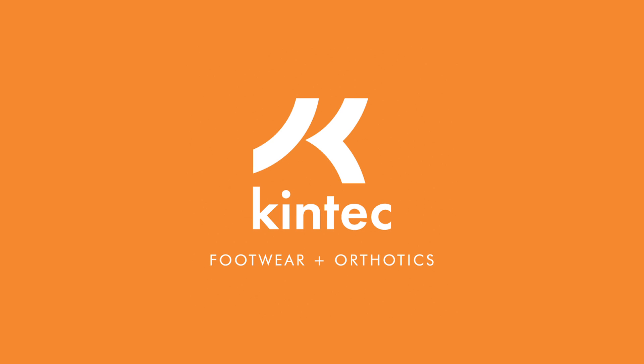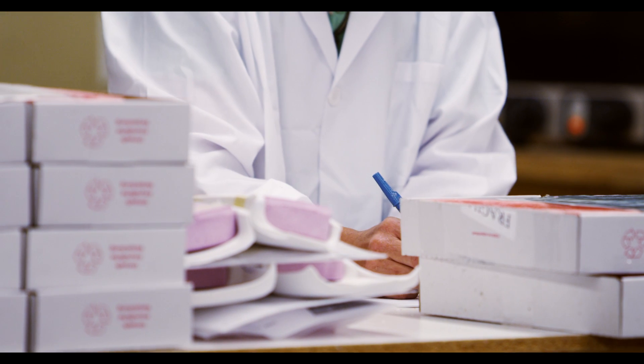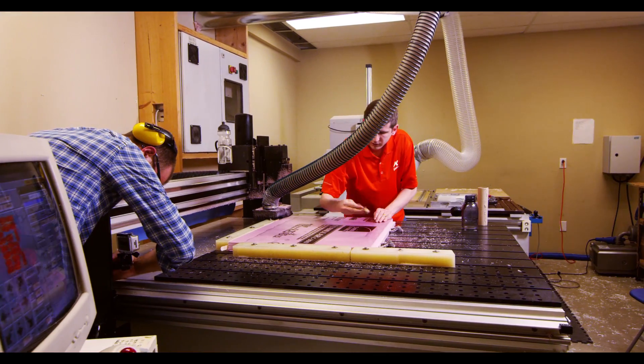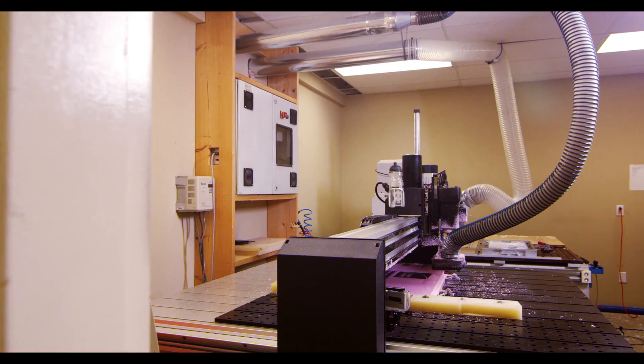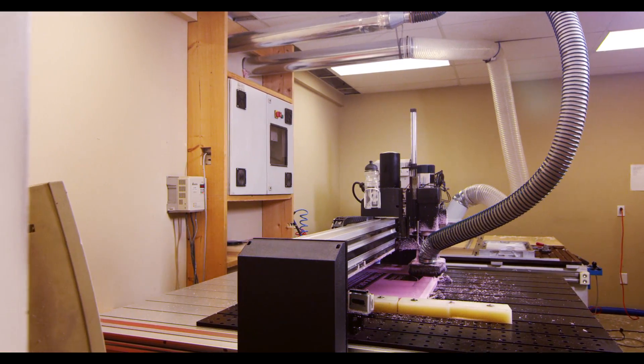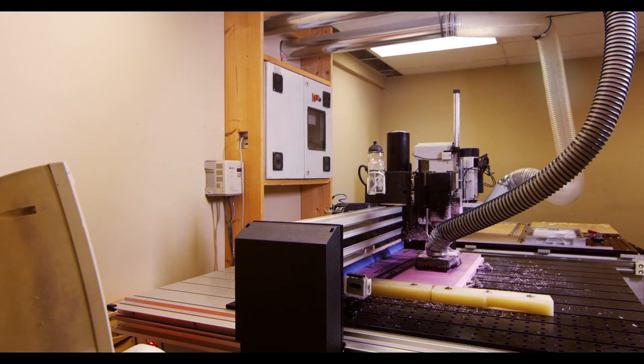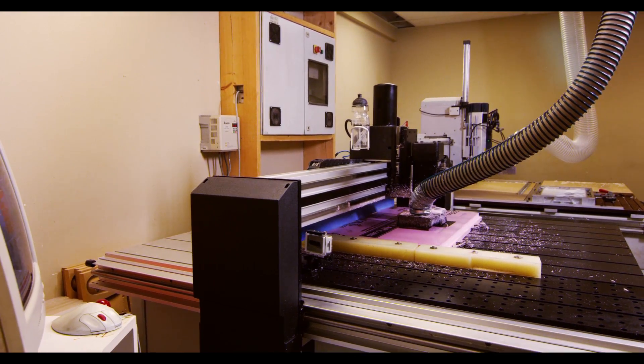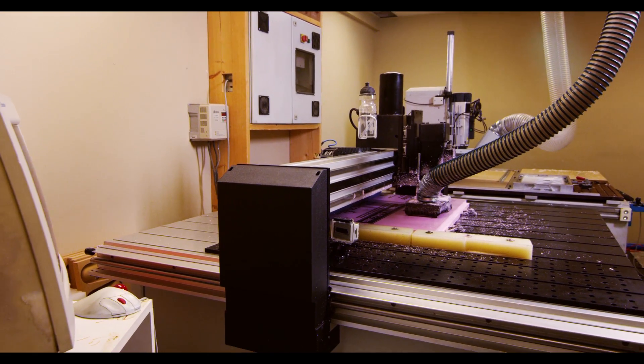Welcome to Kintec's Orthotic Fabrication Lab. We're going to take you into our facility today to show you how your custom orthotics are made. Kintec has one of the most advanced orthotic production facilities in North America. We are a BAPFOL certified lab that produces tens of thousands of orthotics each year.